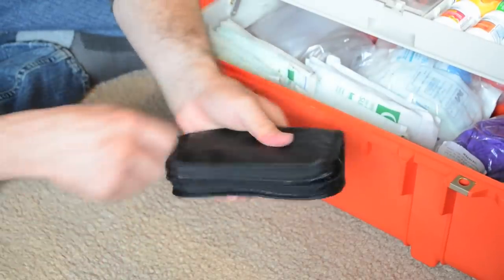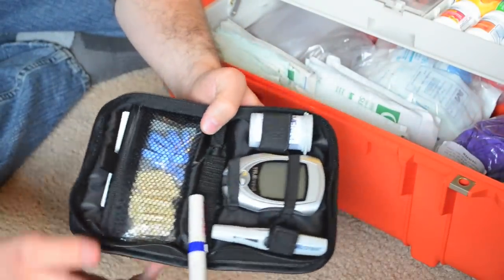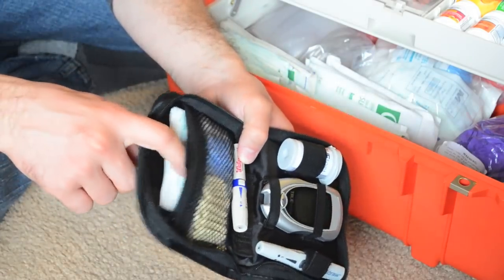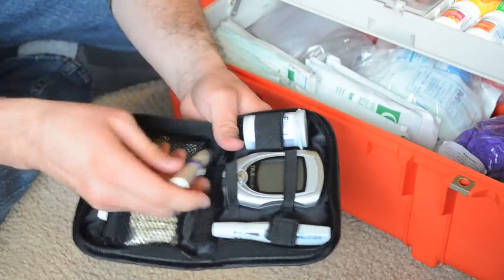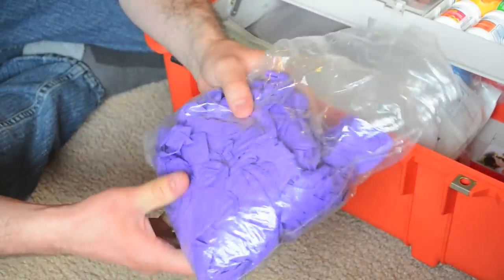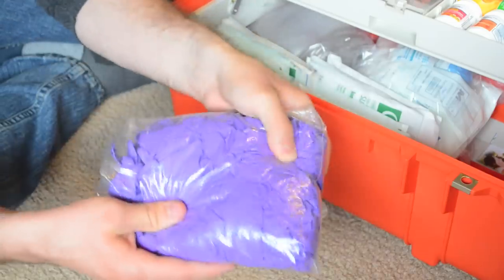Next thing is a glucometer, which allows you to check your blood sugar. Got lancets in here, alcohol preps and band-aids, and then glucometer strips. This device helps you administer the poke in order to get the blood sample. You can never have too many gloves — I didn't want to fit a box in here, so I just grabbed a bag and stuffed a ton of gloves in. This is really, really important.